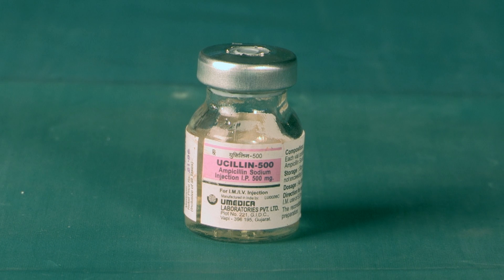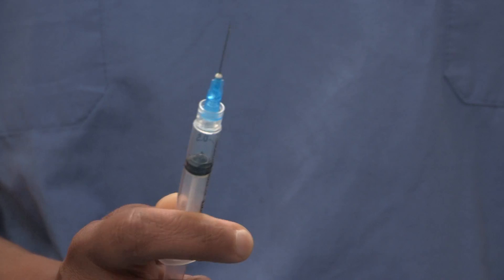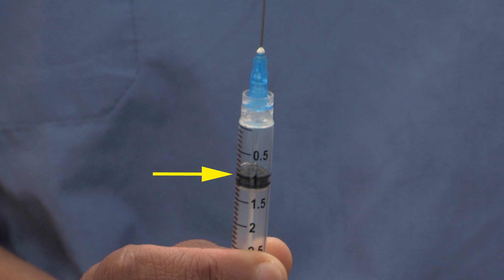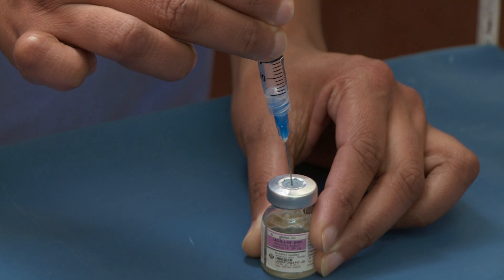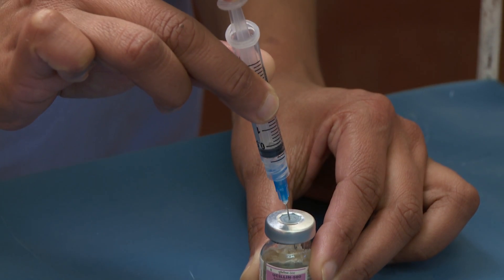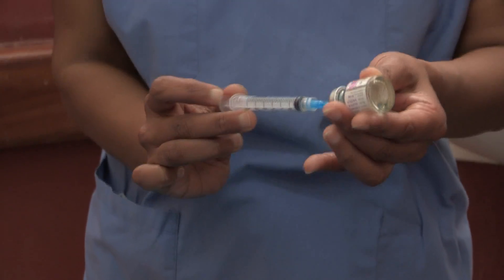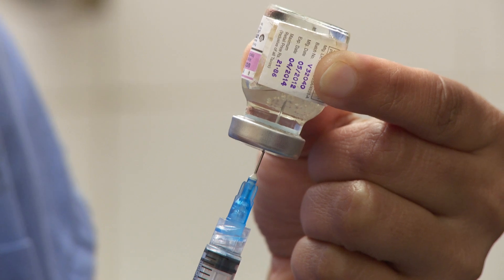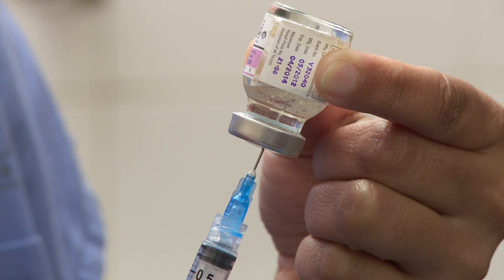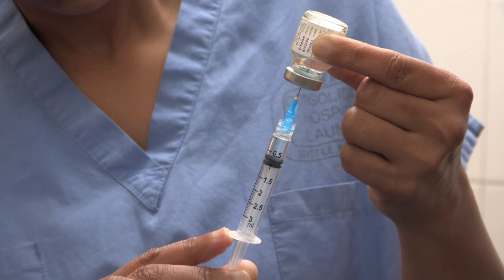Now you're ready to draw up the medicine. First, draw up 1 ml of air equal to the volume of fluid you plan to remove from the bottle. Inject the air into the bottle — this makes it easier to draw the fluid out of the pressurized bottle. Turn the bottle upside down. Be sure the tip of the needle is in the fluid, then pull the plunger until you've drawn up 1 ml.